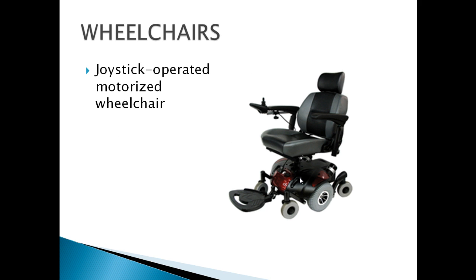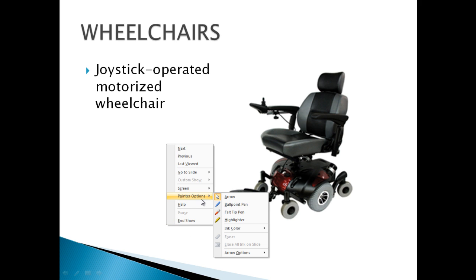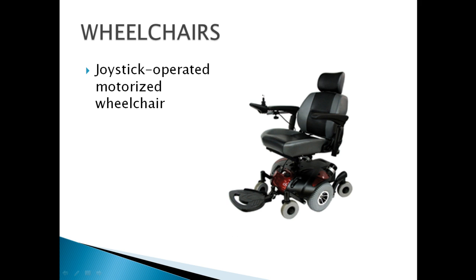Here is an image of a typical motorized joystick based wheelchair. So you can see the joystick control on the right palm rest of the wheelchair. So I'll just highlight it here. As you can see, this is where the patient's hand rests, and he is expected to move the joystick with his fingers so that the wheelchair may be steered.